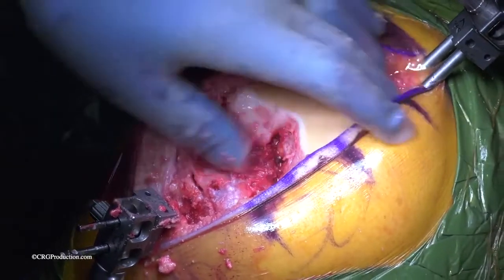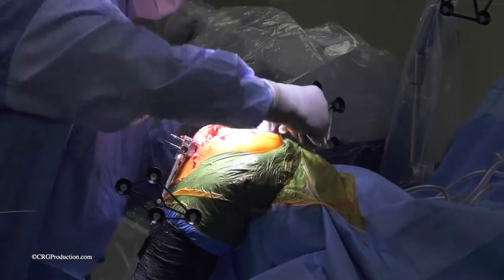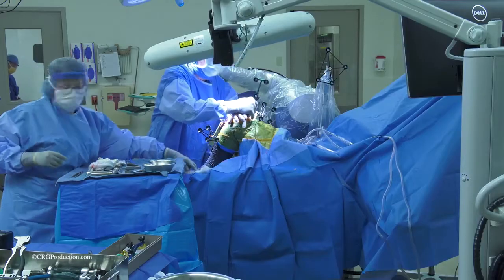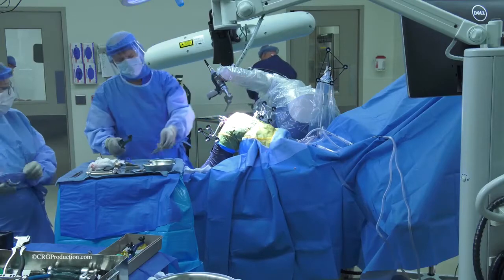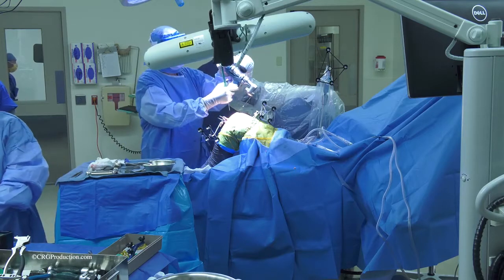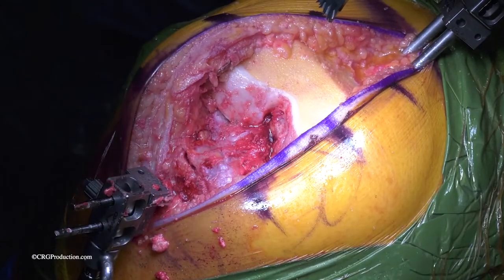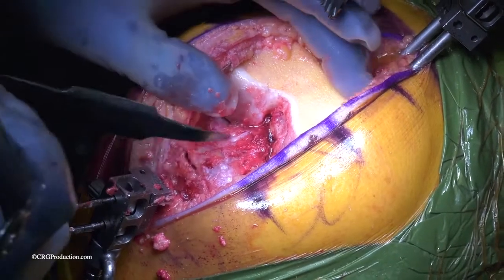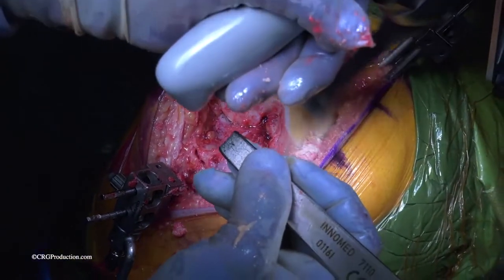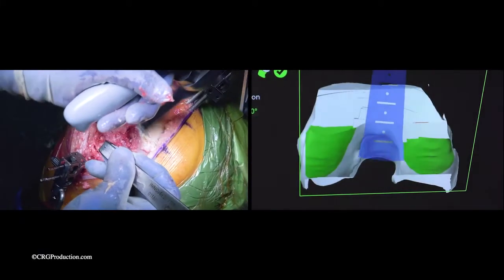Five bone resections are necessary on the end of the thigh bone, the femur, and one on the top of the shin bone. We're completing the last two resections on the end of the femur by the 90 degree saw blade. We can now see that it's set up in a different position than it was before. We again have to go through registration. Again, the retractor is inserted. And the bone resection completed.